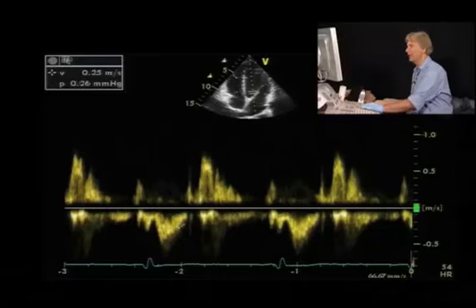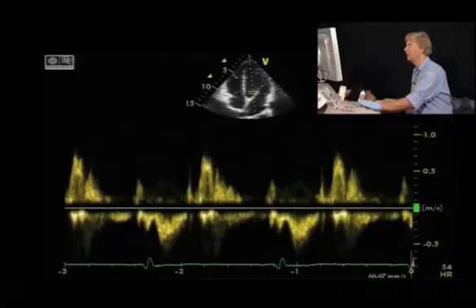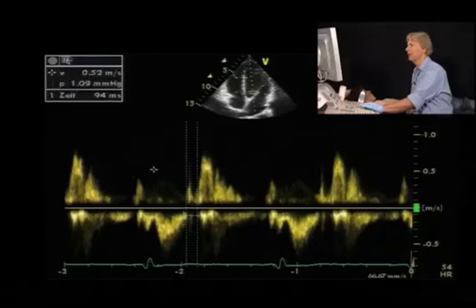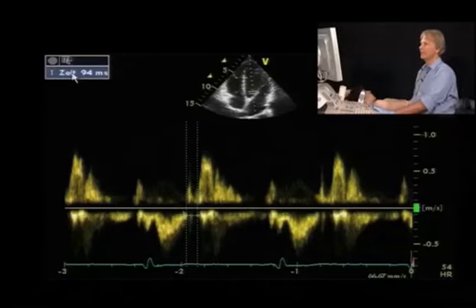You have the aortic signal here, the outflow signal, and the beginning at least of the mitral inflow signal. And the duration between these two signals is the so-called isovolumetric relaxation time. So the end here to the beginning right here. This would be the isovolumetric relaxation time.